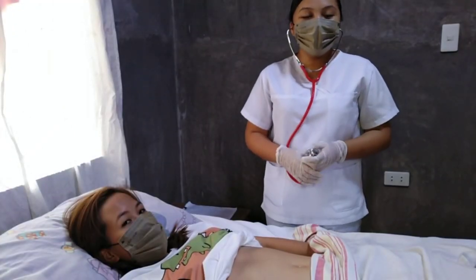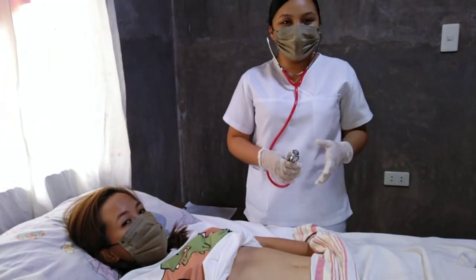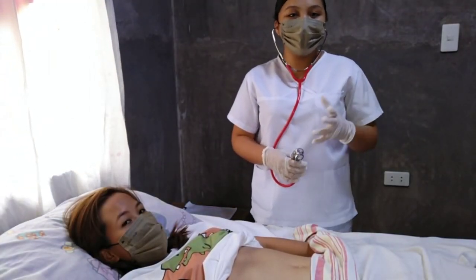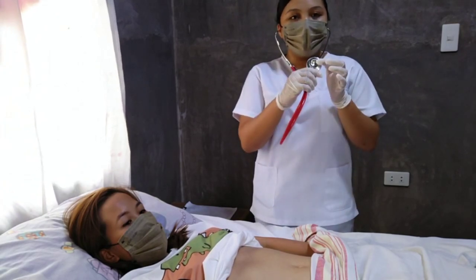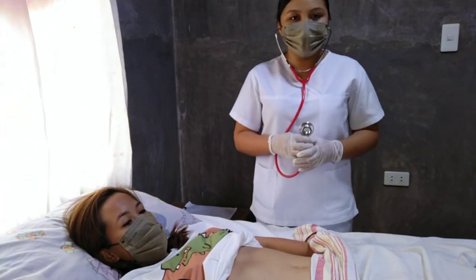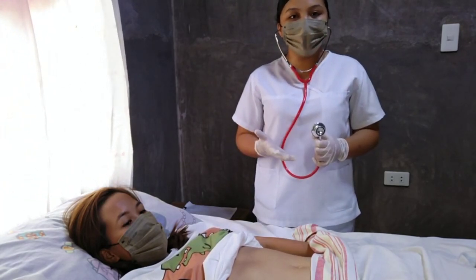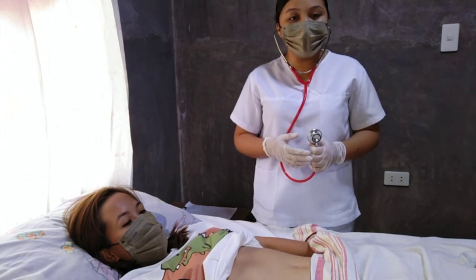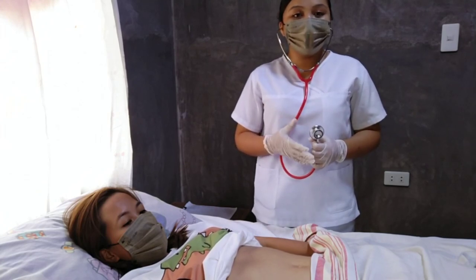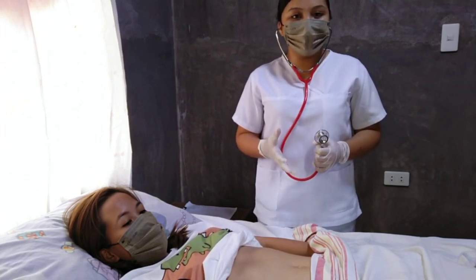Now I am going to auscultate for vascular sounds and friction rub using the bell of the stethoscope. I am going to auscultate over the aorta, renal artery, and iliac artery.